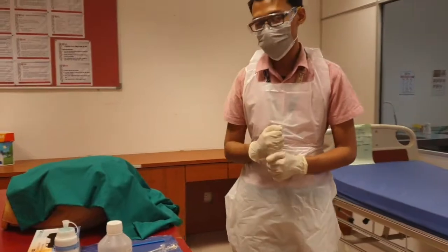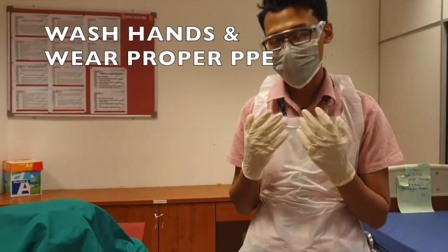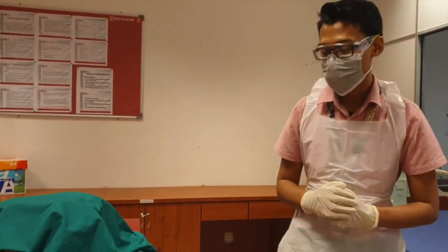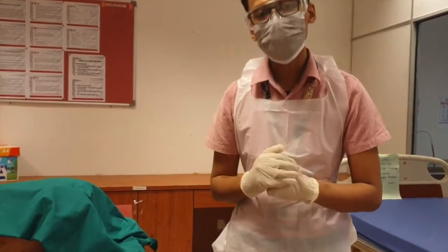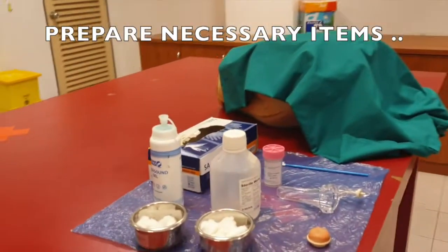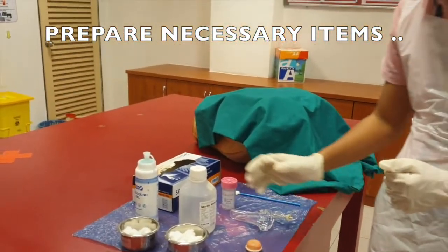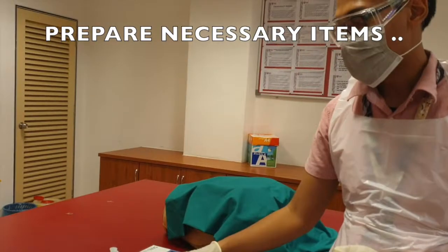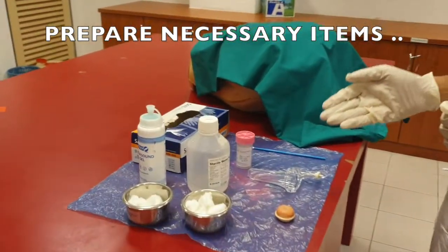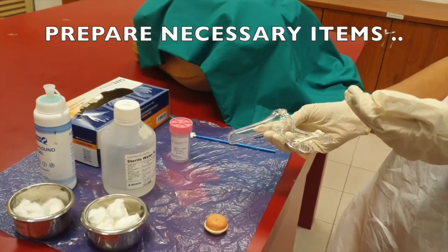First, make sure that we wash our hands, sanitize them, and wear proper PPE: gloves, apron, and your goggles or face shield. Now I will run through the things that we need to prepare for this Pap smear procedure. First thing, to clean the perineal region of the patient, I will need some sterile water and some cotton buds. Then of course we need the speculum. This will be inserted through the vaginal canal to visualize the cervix.